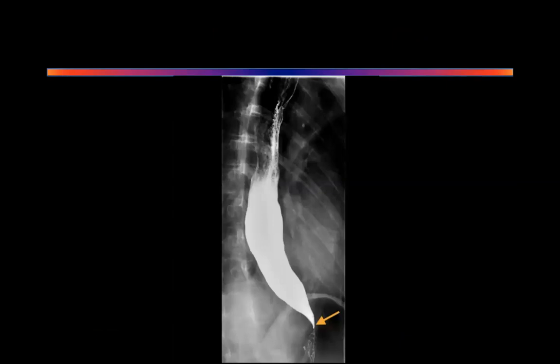Anybody else wants to come in? Achalasia. Rat tail sign. Not rat tail. Parrot beak. Bird's beak. Somebody else take it. Chandan, you want to take it? Yes, sir. This is a chest X-ray showing. It's not a chest X-ray. Barium swallow. The barium swallow film, sir, showing bird beak appearance. Okay. The esophagus. Diagnosis? Achalasia cardia. Excellent. Good. We've done this.